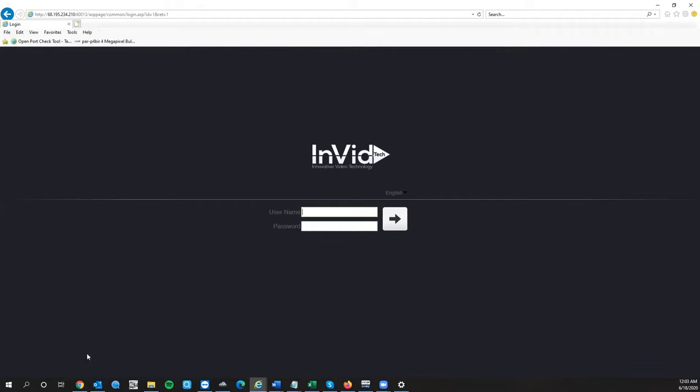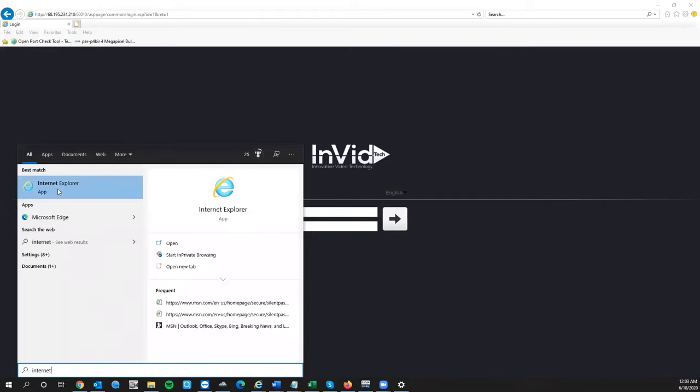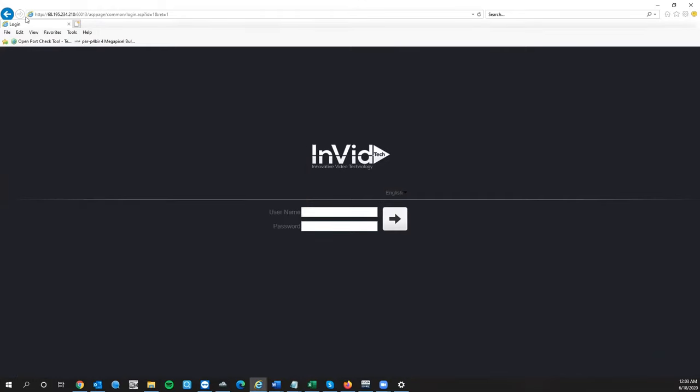Internet Explorer — the blue browser with a yellow ring around it. If you're on a Windows 10 PC, Internet Explorer is often hidden. Hit the magnifying glass in the bottom left, type in the word 'internet', and click on the browser. You get the full range of options and settings to set the camera up. For viewing purposes you can use Chrome or Firefox, but for the setup process, Internet Explorer is highly recommended. Your username is admin and your password is 1234567U. If you defaulted the unit, that password resets to default as well.